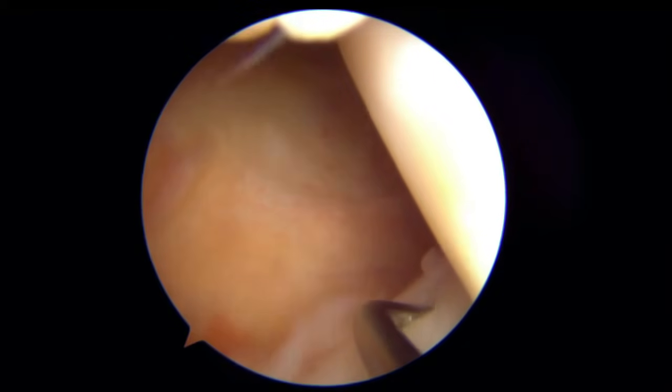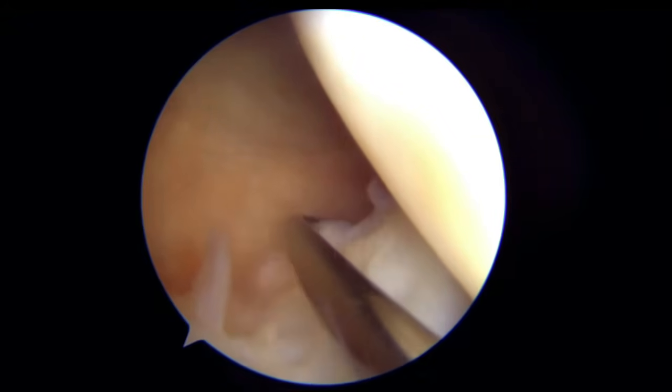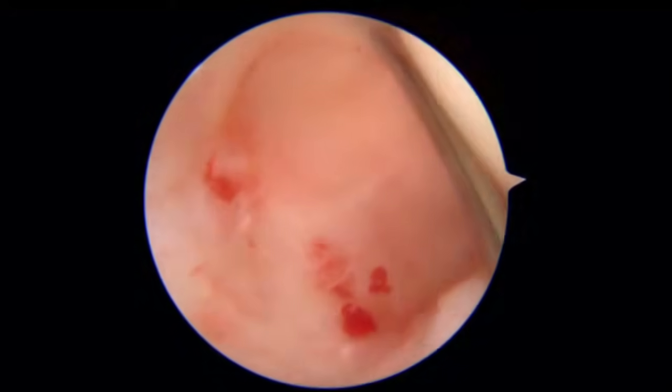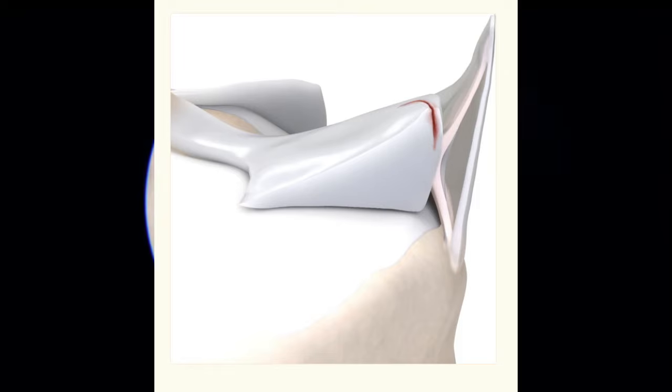Coming to the first case, we have a 30-year-old male football player with an ACL tear. We can see here that the medial meniscus is lax. The posterior horn also is lax and it is coming forward with the probe. But I could not find a tear in the meniscus. So I went posteriorly and checked for the tear with the probe. And my probe gets hooked into the tear. And you find out that it is a type 2 tear that is visualized here.